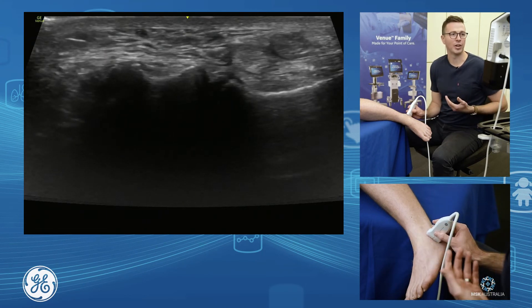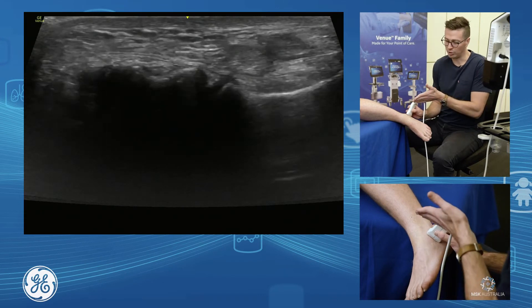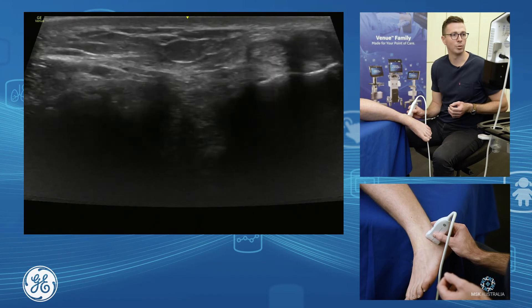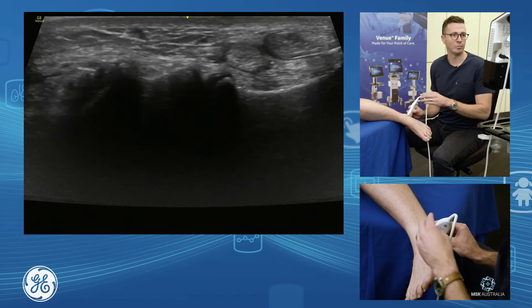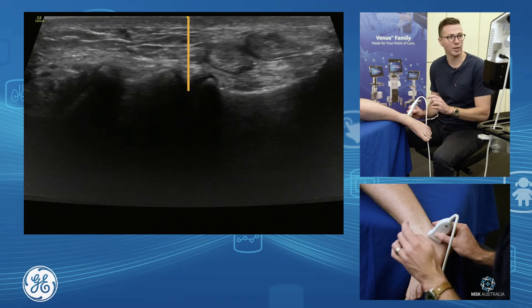For the subtalar sinus tarsi injection, if we see our subtalar joint and drift the probe more towards the little toe, we come off into the sinus tarsi. This is a nice place to do an anterior lateral subtalar joint injection. You can sit yourself up here, go short axis and drop down and in.